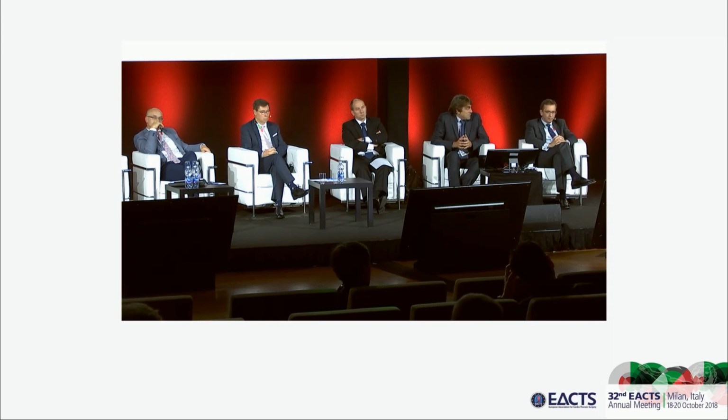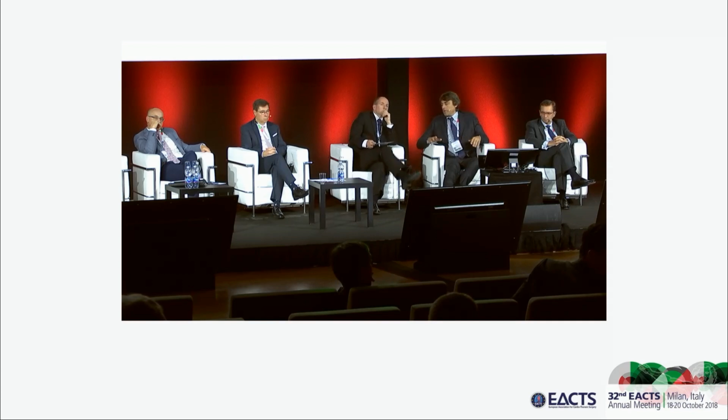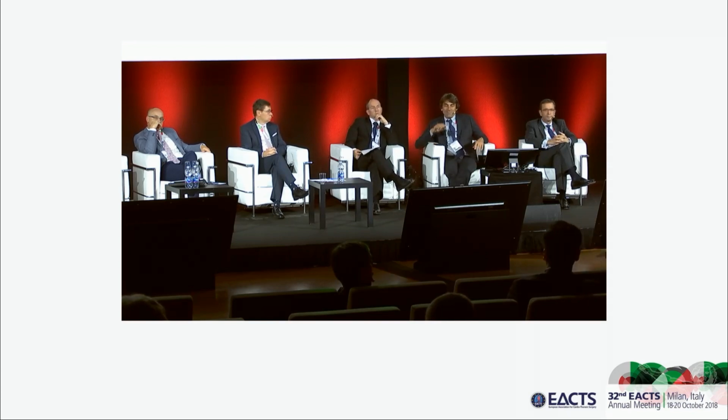For example, we are just measuring height of the commissura in terms of choosing the proper prosthesis size for the reimplantation, meaning that we've got the certain size for the annulus stabilization. Now, just having a strip of Dacron, how do you, at the end of the procedure, make sure that you end up with the proper or predicted size of the annulus?